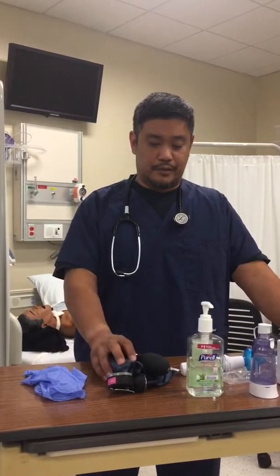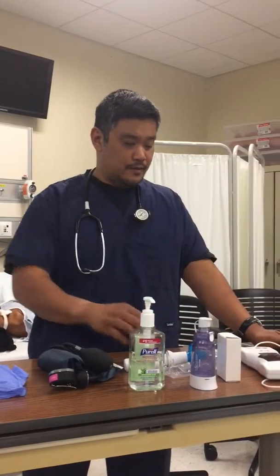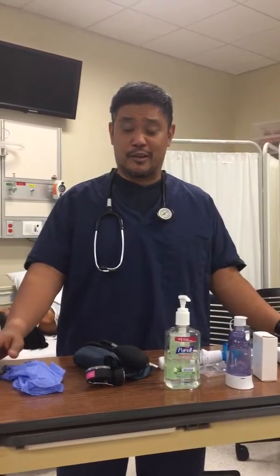In this case, I will go ahead and gather my equipment. It'll be gloves, blood pressure cuff. We have a peak flow meter and a pulse ox as well as my stethoscope. Once I get them sanitized, I'll be ready to enter and I'll go ahead and knock.